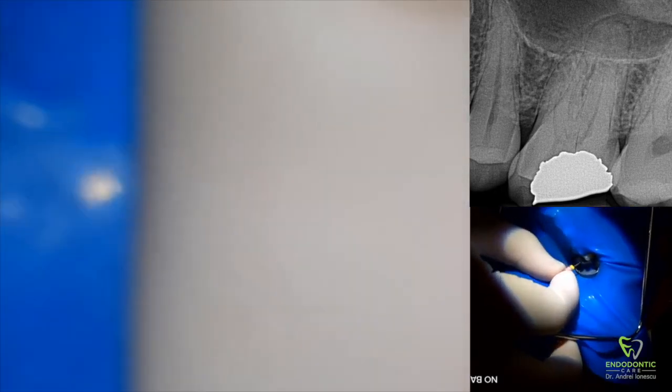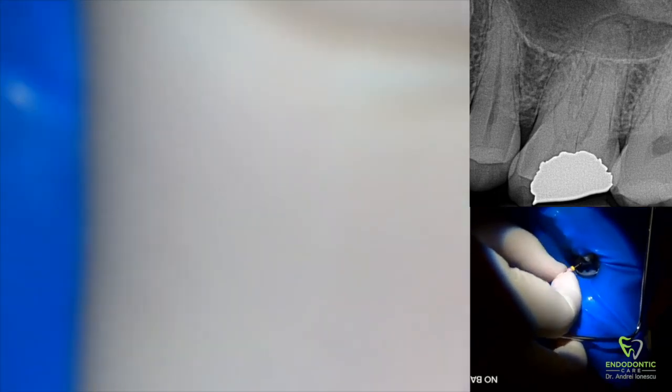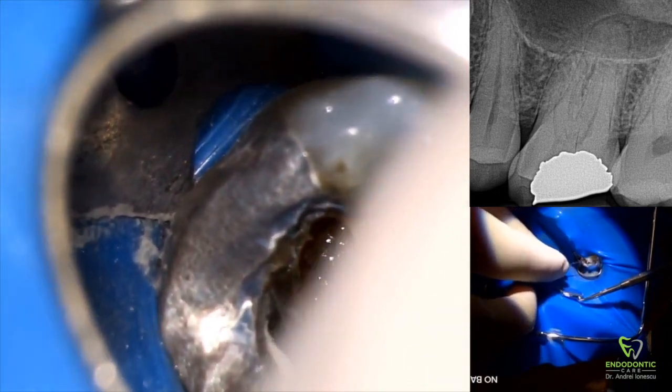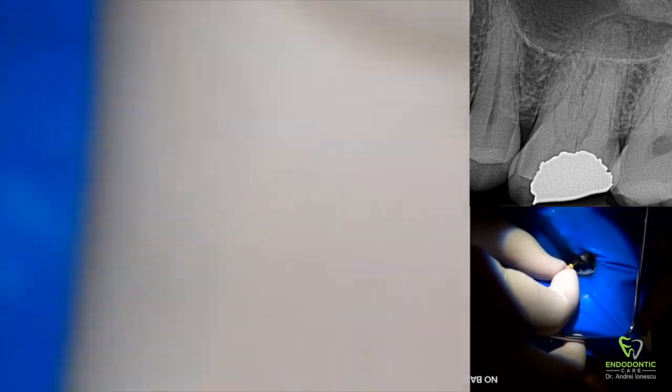Now I'm starting to feel the apical constriction on the distal buccal canal — I know I'm close to the apex. I'm using a picking motion: basically a 25-degree rotation clockwise with apical pressure, then pulling back, and repeating over and over until I feel through the apex. You can also have the apex locator hooked on at the same time for confirmation. Slight apical pressure, 25-degree clockwise turn, then pull — you'll feel a little tug back as you pull, giving you confirmation you're engaged and not creating a ledge.